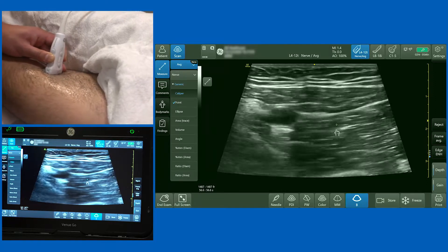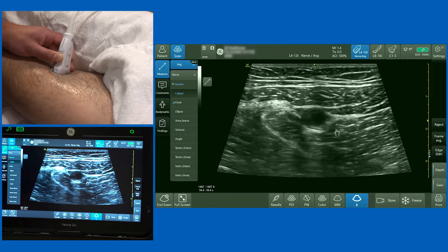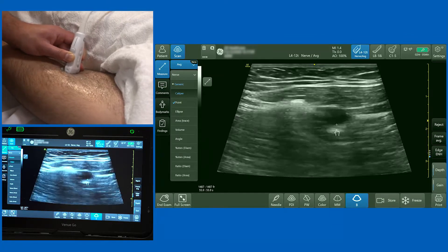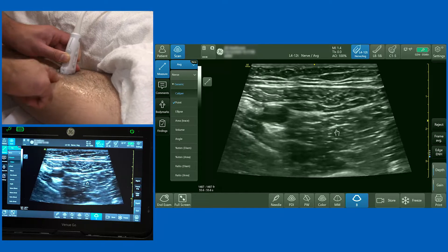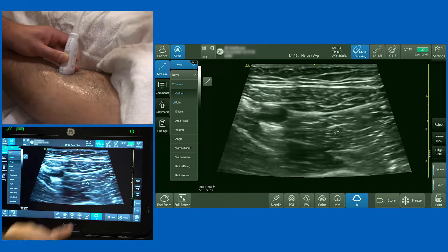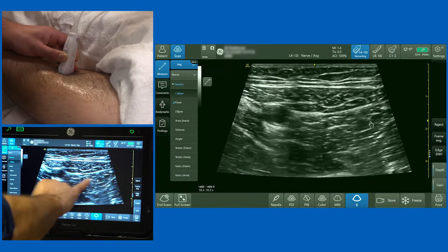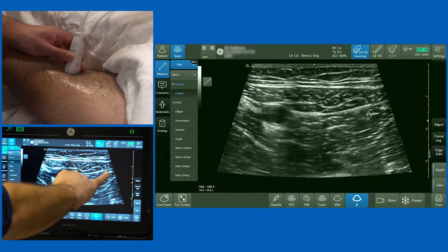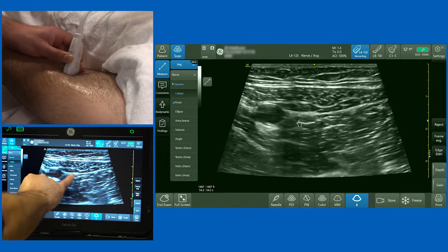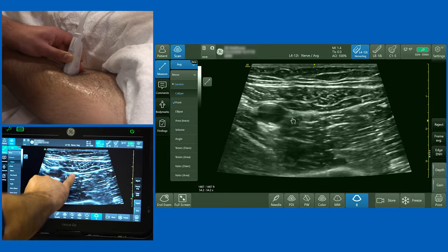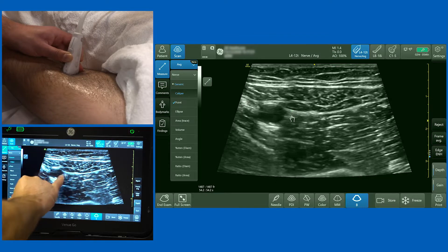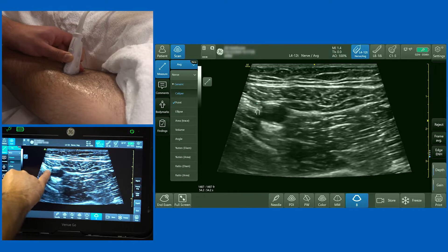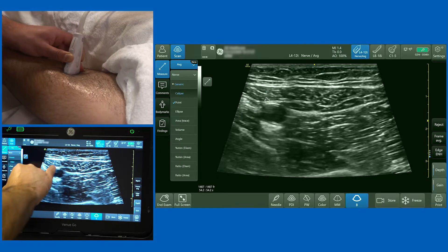Most people would inject somewhere between 10 to 15 millilitres of local anaesthetic around the superficial femoral artery, approaching from the lateral aspect either traversing through the vastus medialis muscle or coming down the groove between sartorius and vastus medialis and hydrodissecting as they go. The aim is to get local anaesthetic preferentially on the lateral aspect of the artery, but occasionally you can get your needle over the top of the artery and over the medial aspect as well.